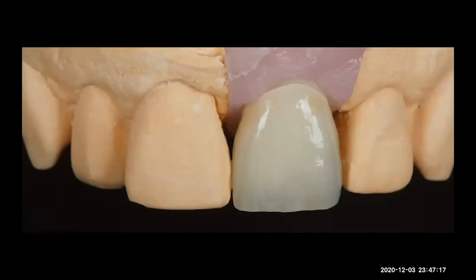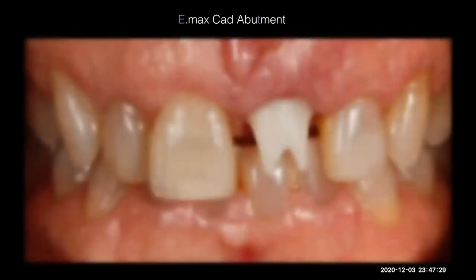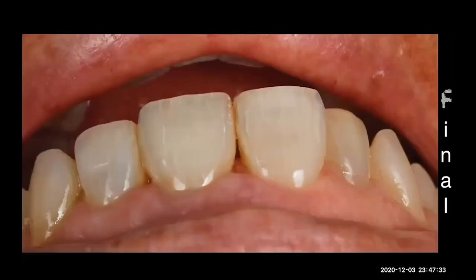Here in our model, here is the tooth that we need to match. Right? This is the abutment in place. And this is our final crown. Okay? So this is something where you need to pick the right ingot.